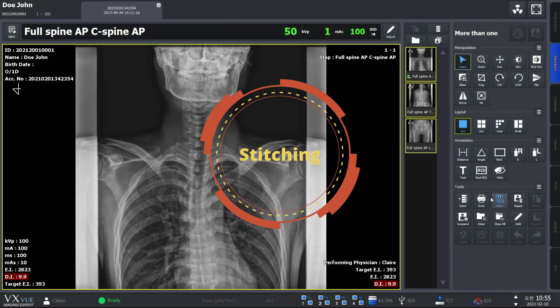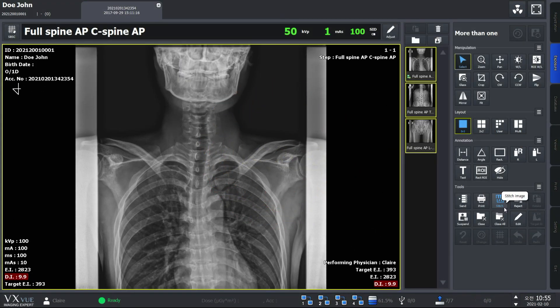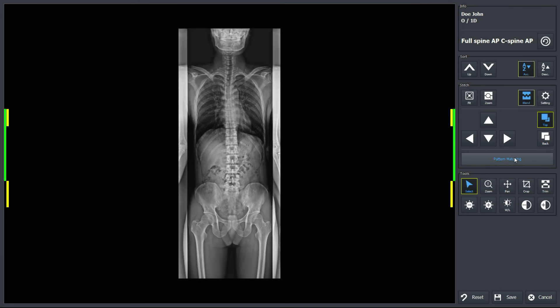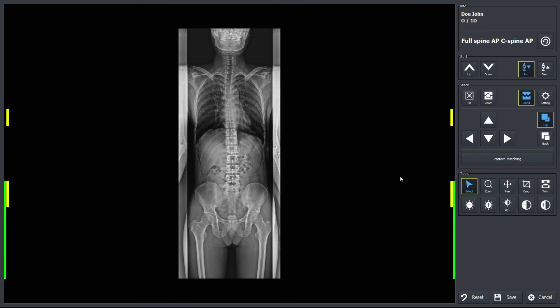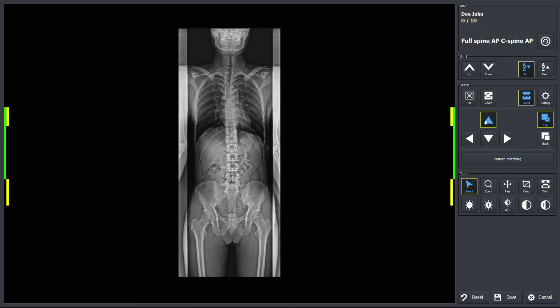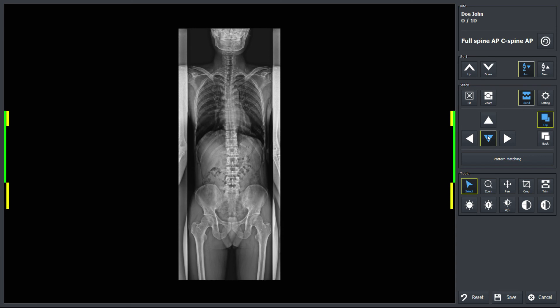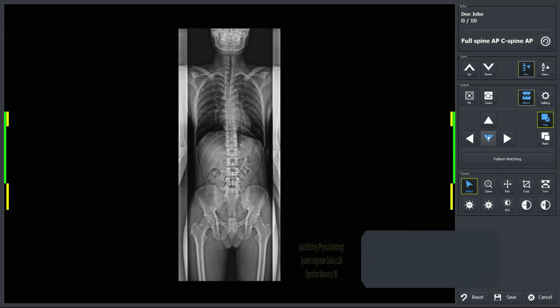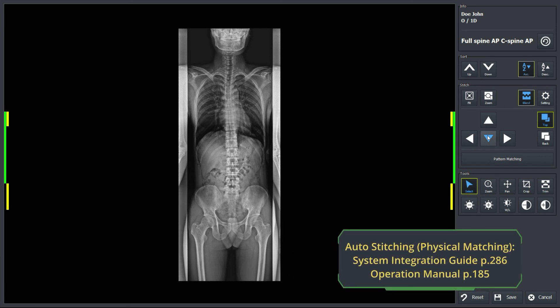The Stitching function enables you to stitch two or more images into one image. Here you'll see three images ready for stitching. Click Pattern Matching and you'll have the three images combined into one in a second. You can still select individual images and move them up or down if you need to further adjust. VXView also provides an auto stitching function or physical matching if it's integrated with the system. You can check the detailed information and prerequisites at our system integration guide.